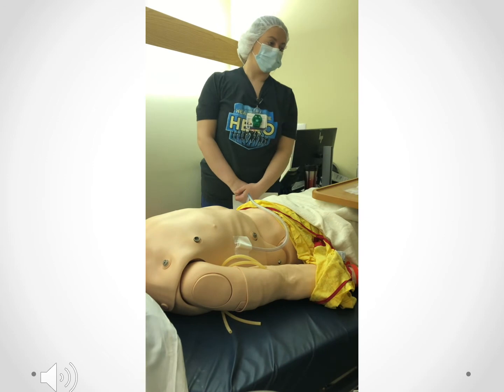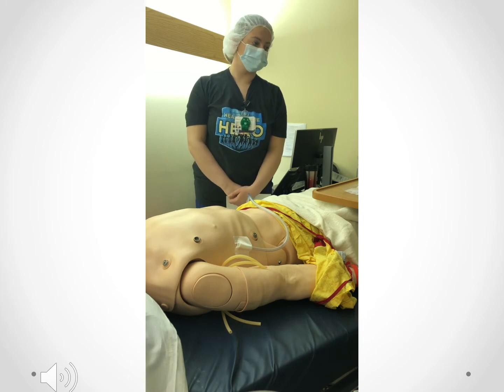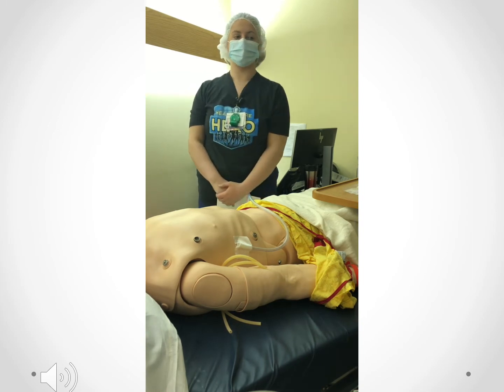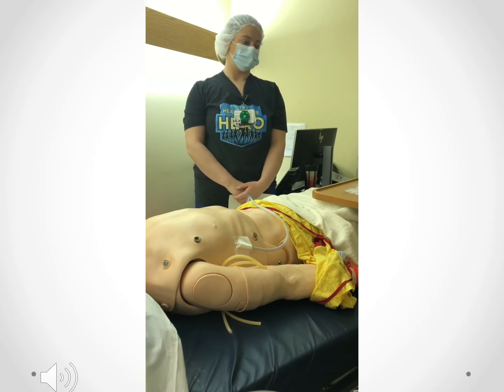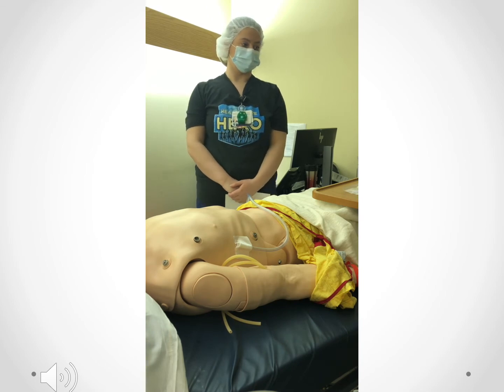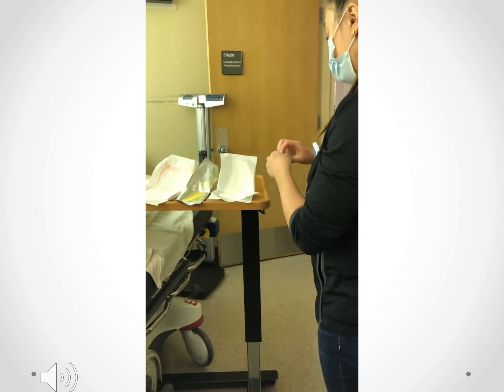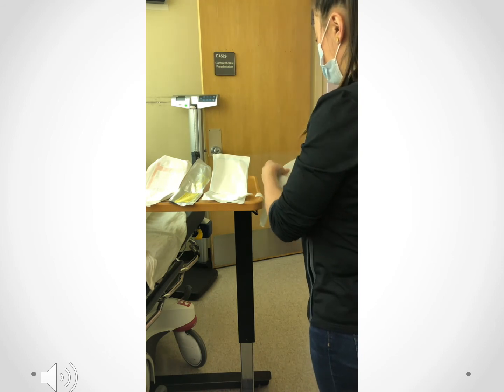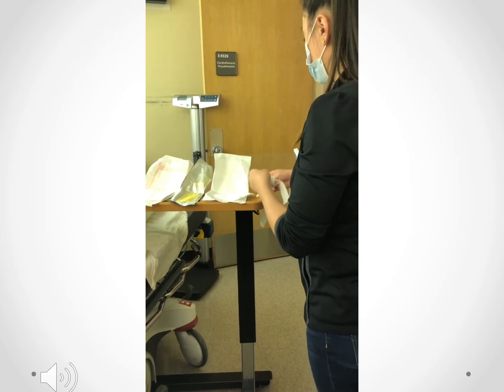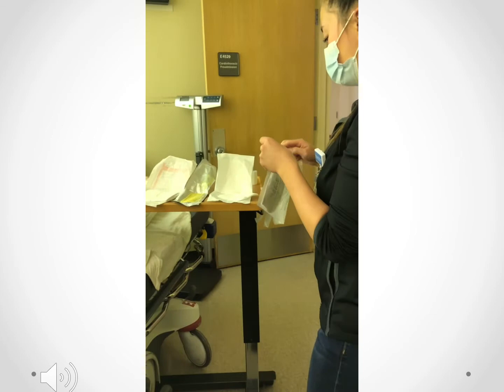We have chlorhexidine, we have xeroform, we have split gauze, regular dry gauze, as well as tape. And then here we have our securement device to hold the chest tube.